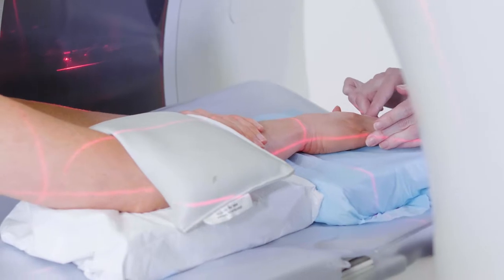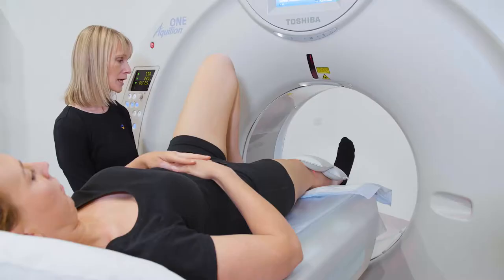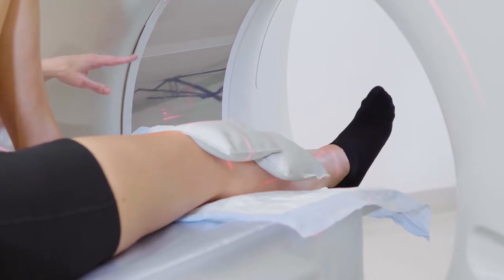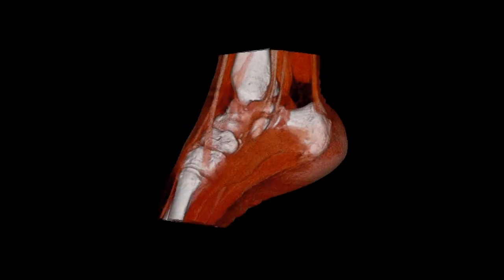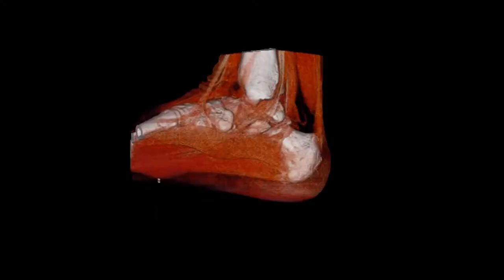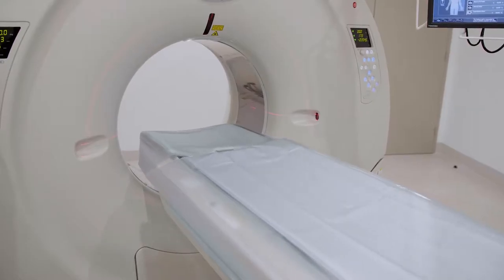The Equilium One, with its 16 centimeters of coverage and 0.5 millimeter detector, enabled us to answer the clinical questions posed about instability or impingement at different joints around the body, and this led us to purchase the Equilium One.